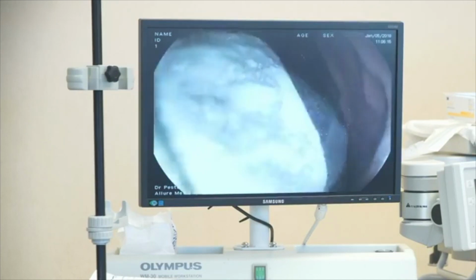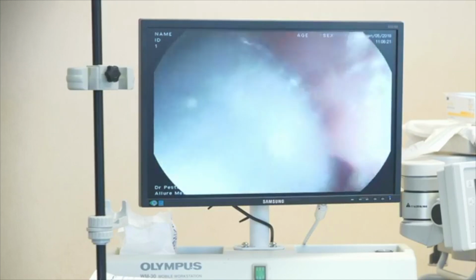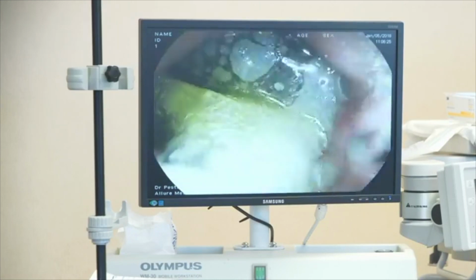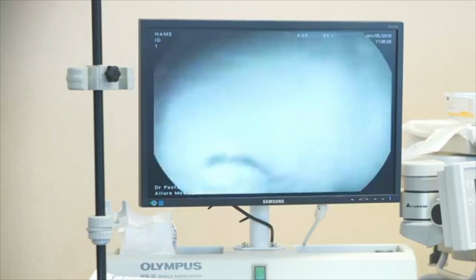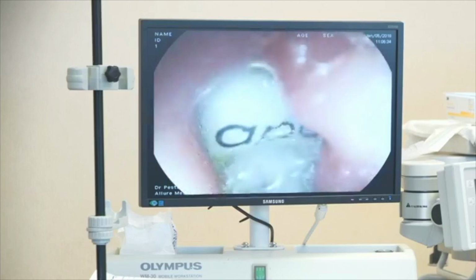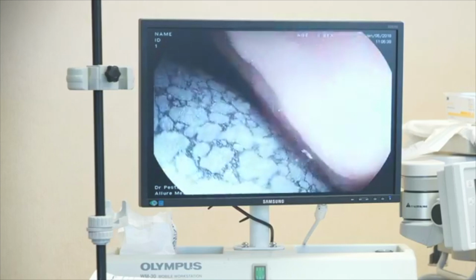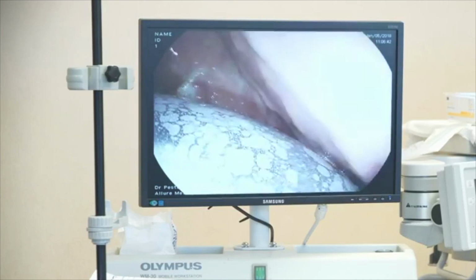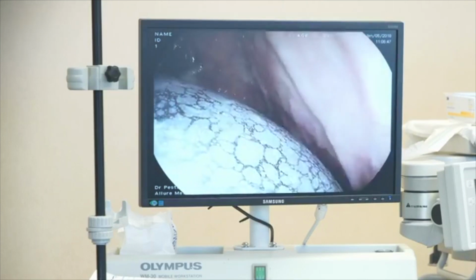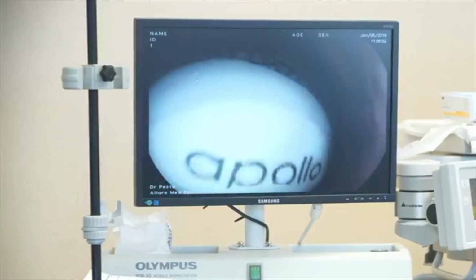And the whole procedure in general takes about 10 minutes, as you'll see, starting with the sedation, to full inflation of the balloon, to the end of the procedure. See the balloon filling in place here. Okay. I'm going to stop at about 580. And we're almost completed with the balloon full. All right, the balloon is now full.